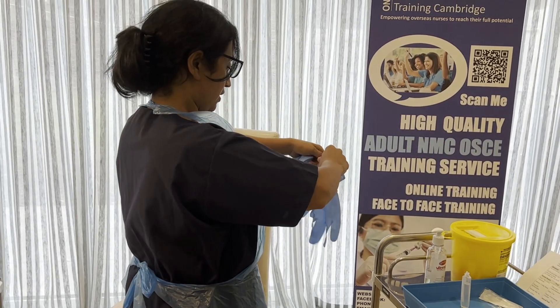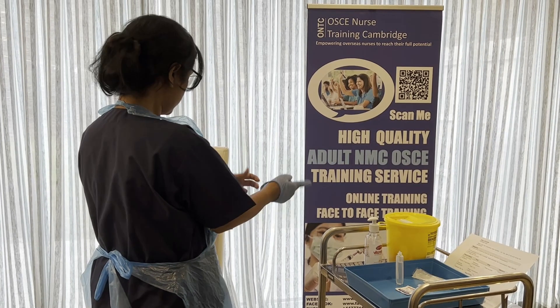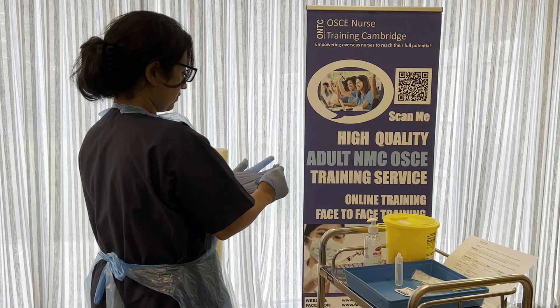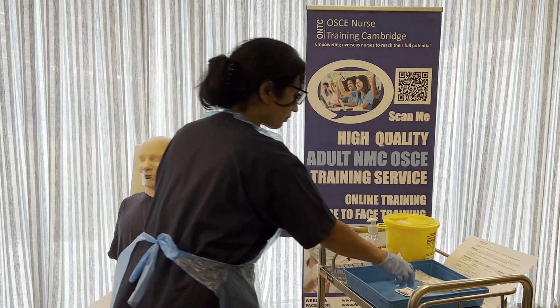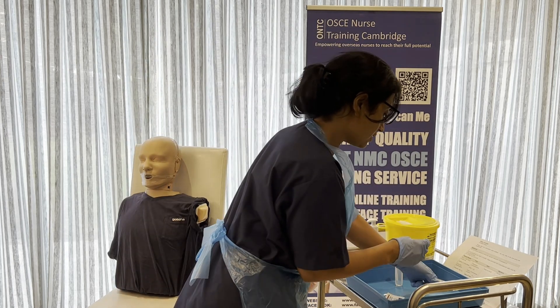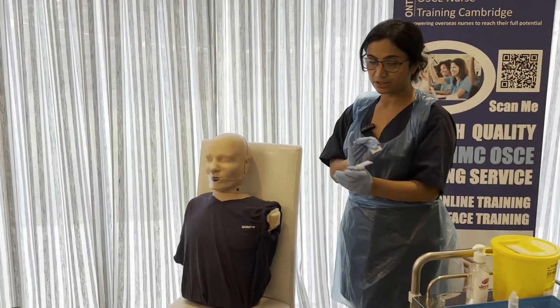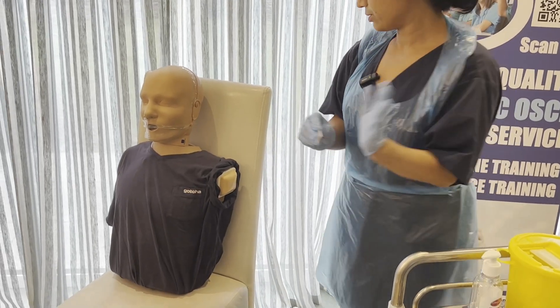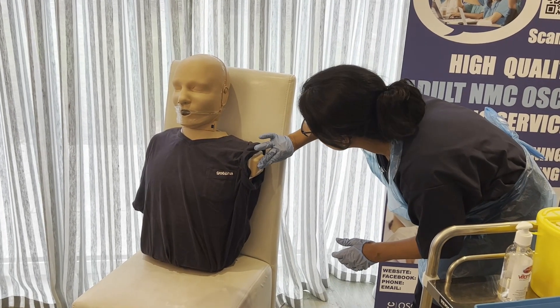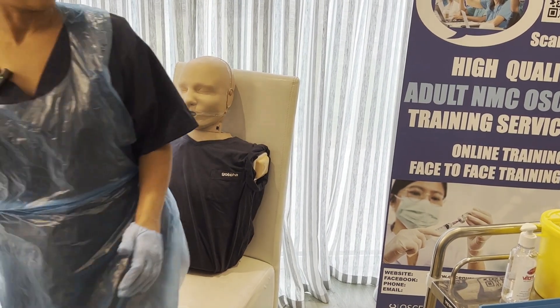I'm applying a fresh pair of gloves. Because I touched the patient's skin before, we clean our hands and put new gloves on. For IM injection, the new marking criteria requires you to clean the skin. The syringe still has the cap and safety shield on — it's shielded and clean. We'll clean the area for 30 seconds and let it dry for 30 seconds, then dispose of the swab in clinical waste.